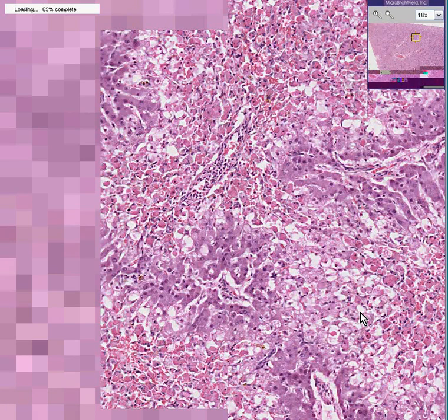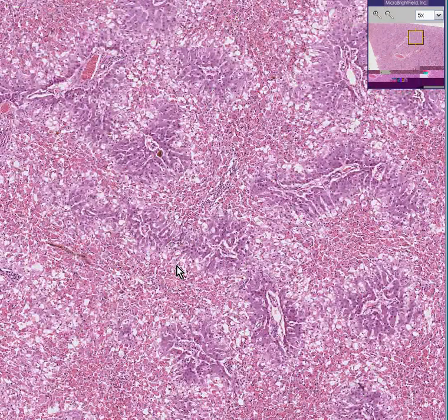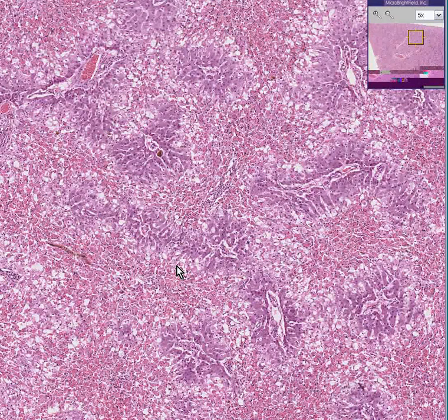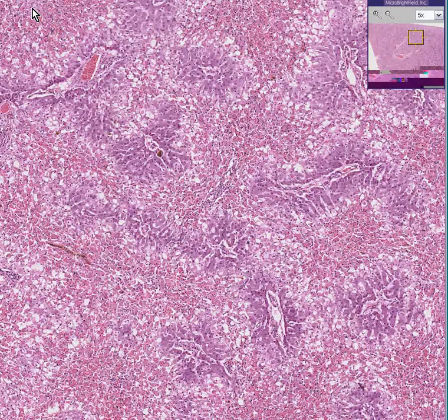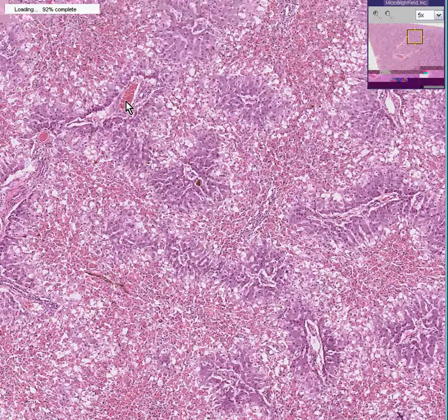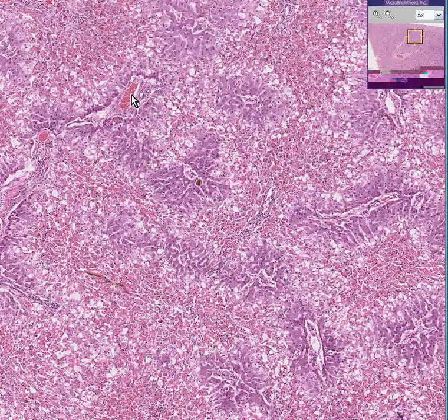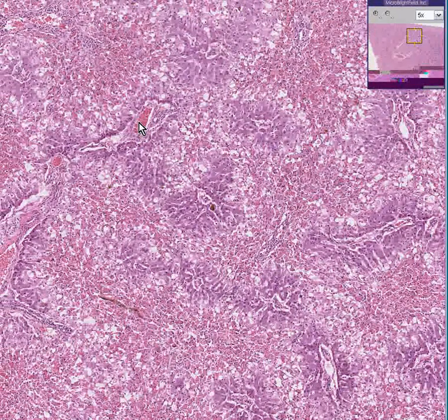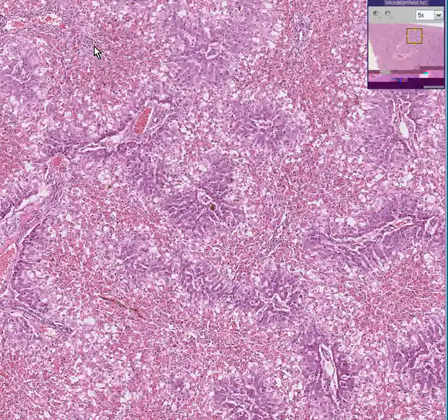As though they had been acutely poisoned, and there is no evidence of any increased fibrosis in this liver either — just an acute necrosis in the central vein areas. So what could do this? If you remember the general flow of the liver, the portal flow is about three times more than the hepatic arterial flow. The vast majority of flow goes from the portal vein to the central veins through the sinusoids and then up into the hepatic veins. If there was a toxic compound, the very first group of liver cells to encounter it would be the ones around the portal area, and if there was an anoxic or hypoxic problem, the areas hardest hit would be the central lobular areas, like central lobular necrosis with heart failure.